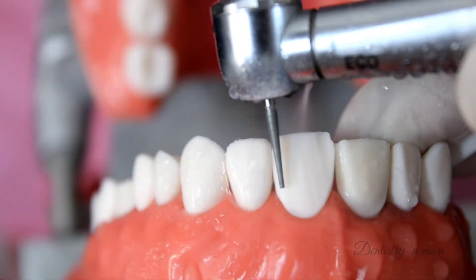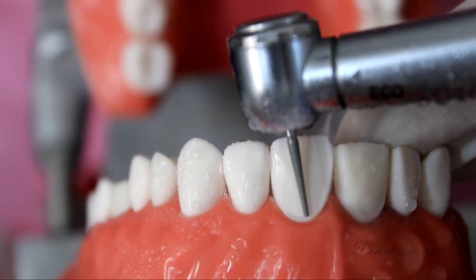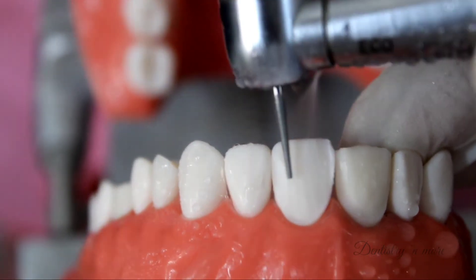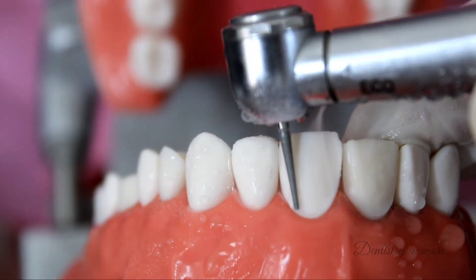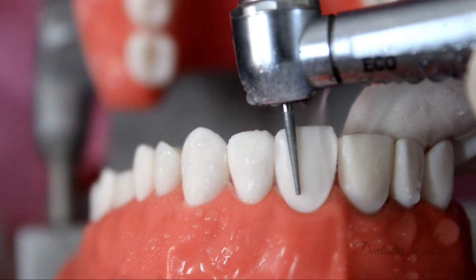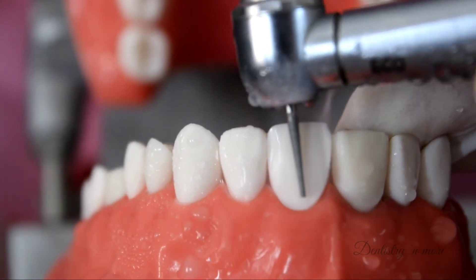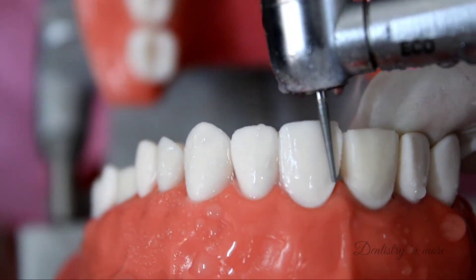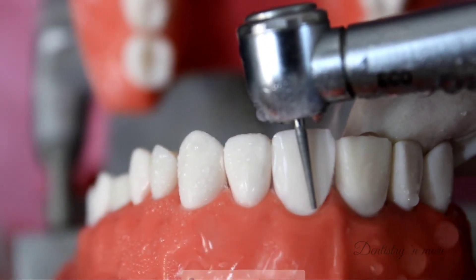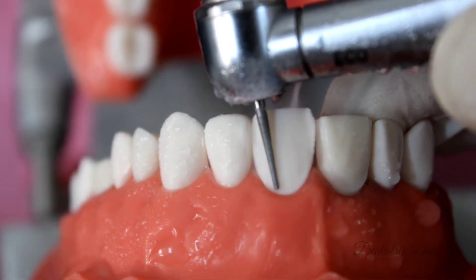Placing the burr parallel to the long axis of the tooth will do most of the reduction and provide the adequate taper required, and the preparation should be free of any undercuts. I extend the preparation as much interproximally as possible without breaking the contact point, so that when I use an interproximal burr it is easier to break through. It has to be kept in mind that 0.2 to 0.3 mm of reduction needs to be kept for the final finishing and polishing.